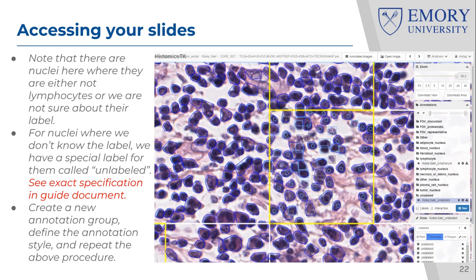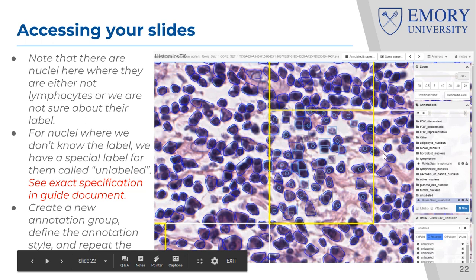And only after you've done this for a few fields of view, maybe at least 10 fields of view, and you're comfortable, you know what a lymphocyte looks like, you know what a tumor cell looks like. Only when you've done that, then you can label vague cells as unlabeled, okay? So this is very important. We don't want to escape from labeling things just because we're not experienced. But if we are experienced, for example, you're a senior pathologist and you're saying, you know what, I really can't tell, I really need immunohistochemistry to know this, then if the nucleus really cannot be told from H&E, you use the label unlabeled, okay?